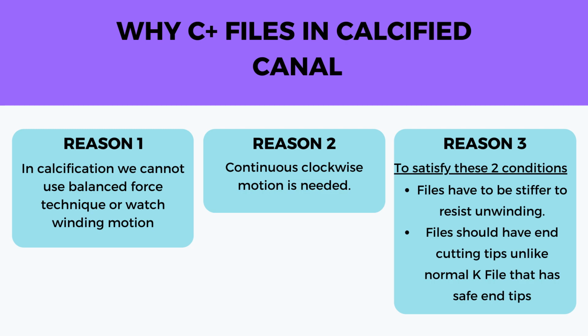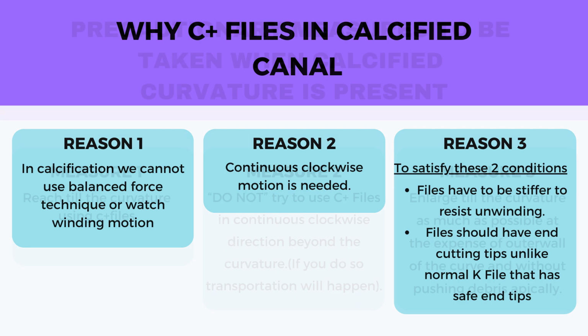Balanced force technique or watch winding motion will not work with calcified canals, because as soon as you enter, you again go back to remove the debris. So that is when you are supposed to use C+ files. That is why you are supposed to use C+ files in these circumstances.